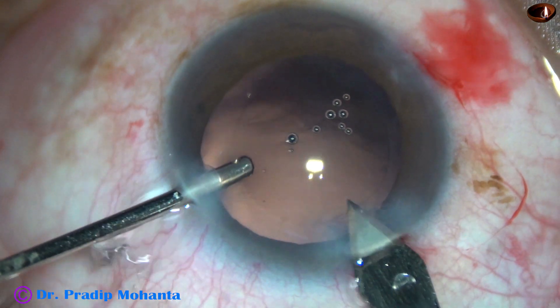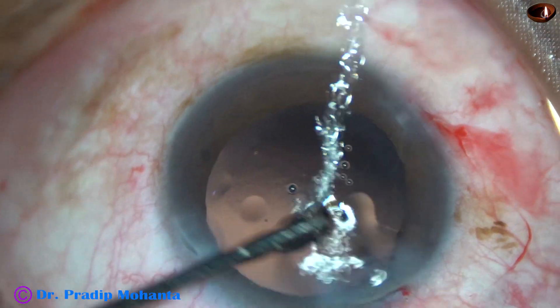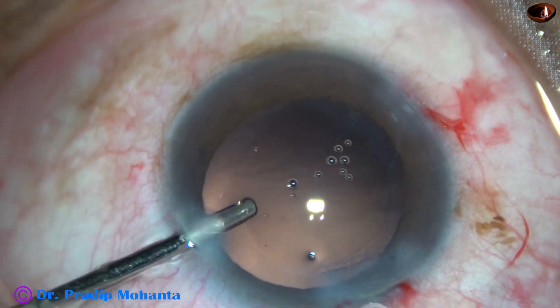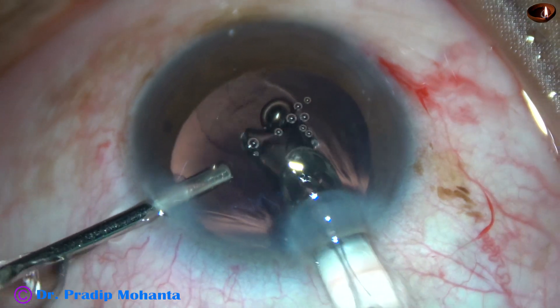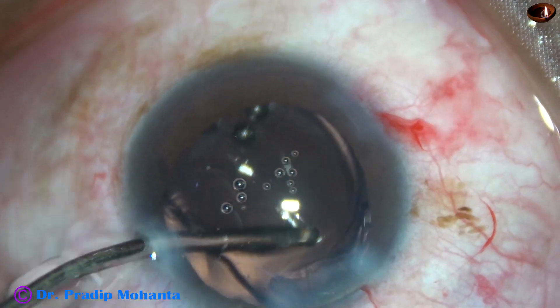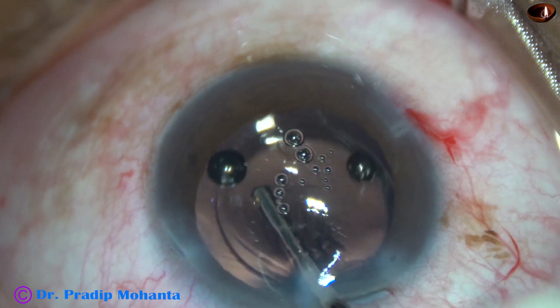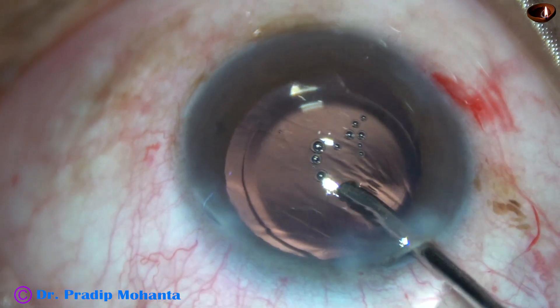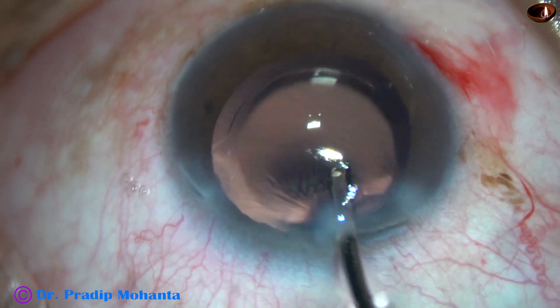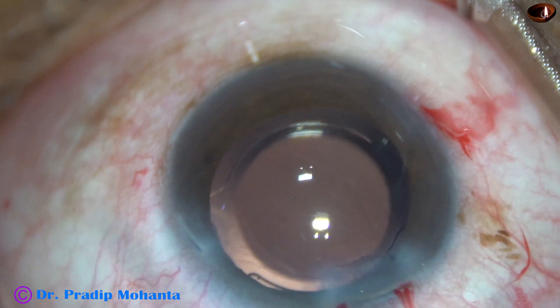So I make only one or two cuts and enlarge the incision to about 3 mm. Now this is the intraocular lens being inserted. Both the haptics have gone into the capsular bag. Now I use the irrigating probe to irrigate the anterior chamber and remove the visco that was in the lumen of the cartridge. So it is done.